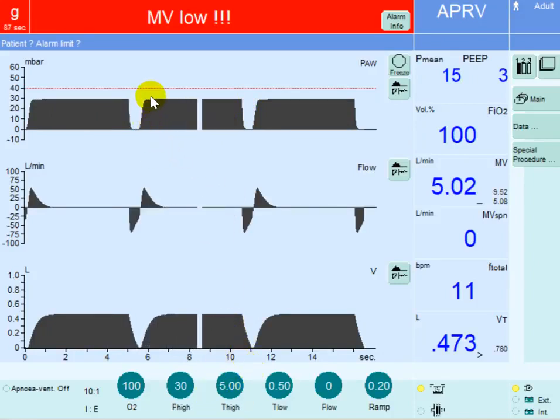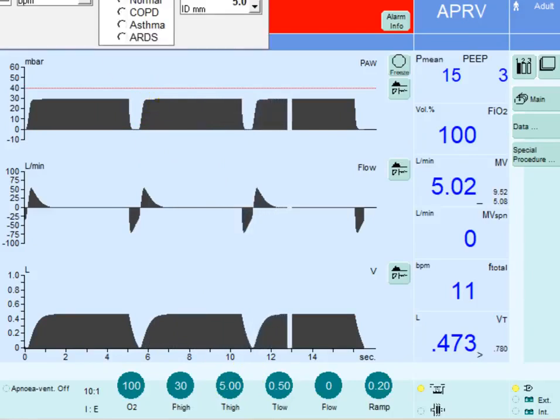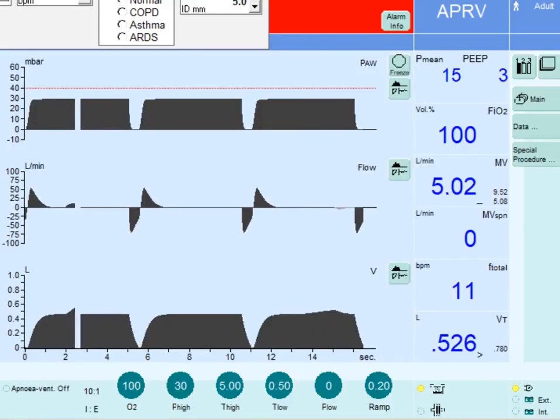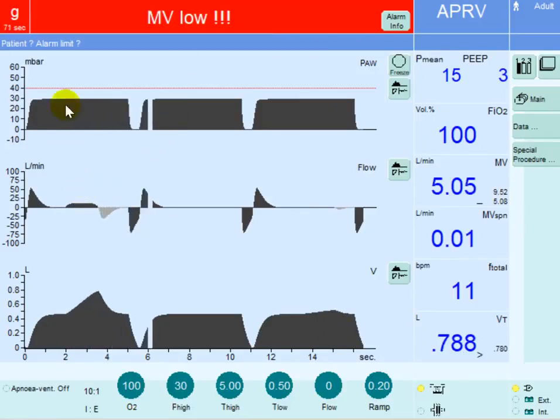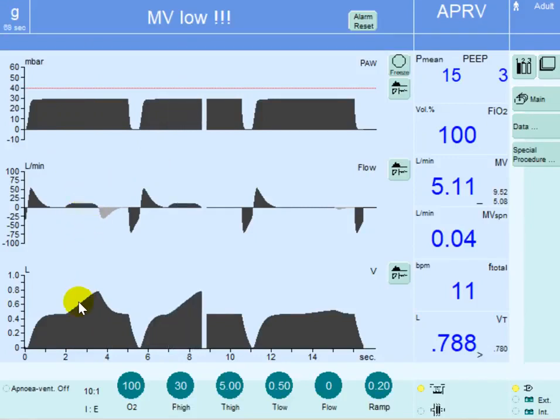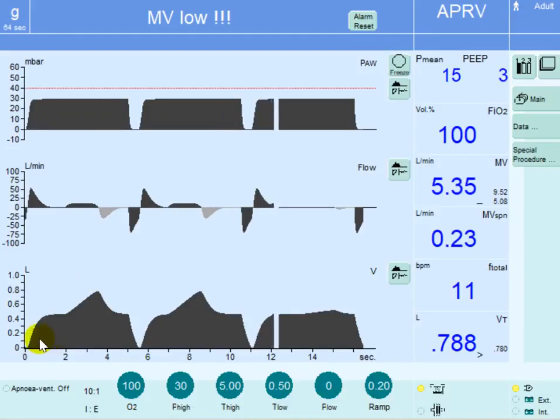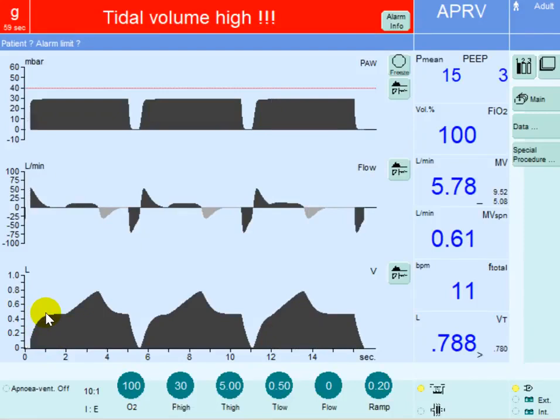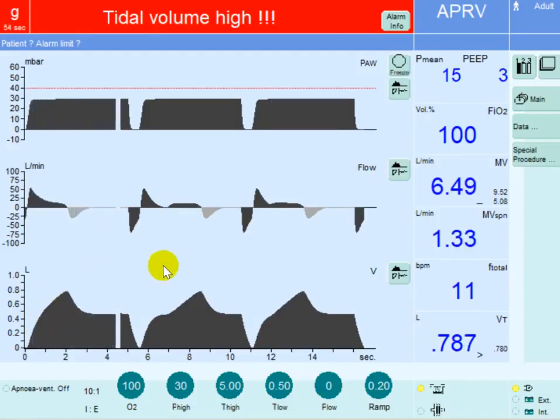The patient can breathe spontaneously at any time above that peak pressure, contributing their own tidal volume above what is already delivered by the machine. You can see here how the patient generated flow and increased the tidal volume above the machine-delivered volume. This is a brief description of APRV — how to set it and how to maintain it.